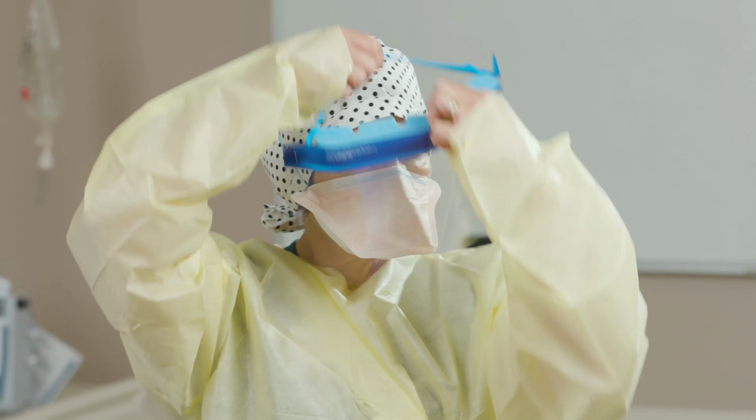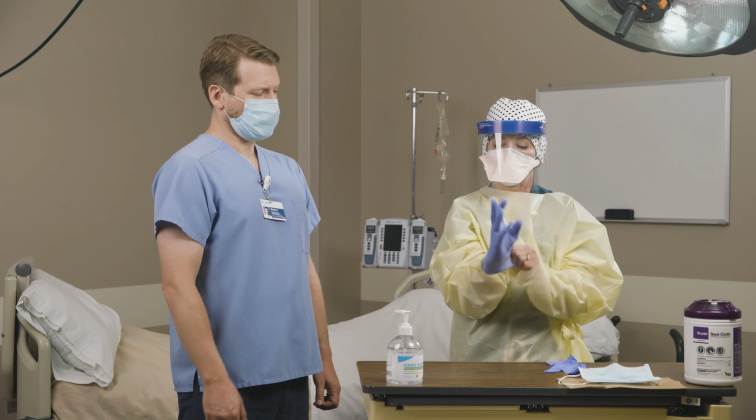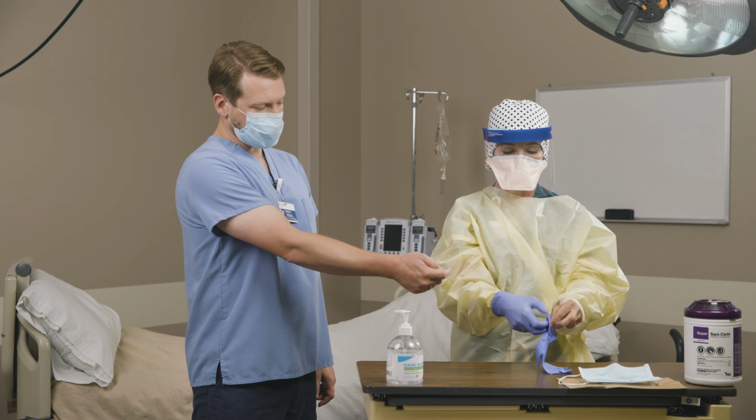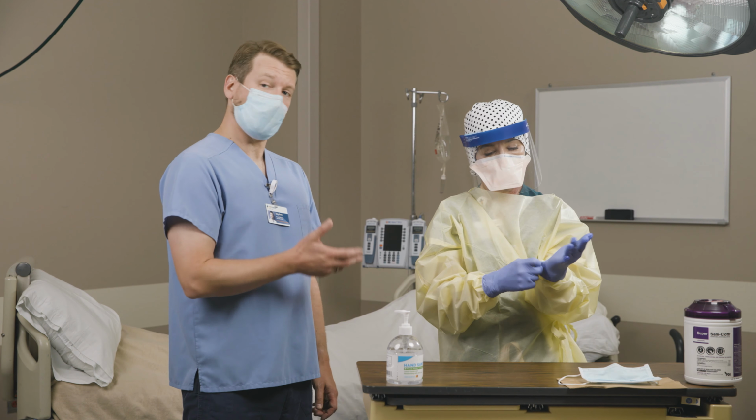Krista's then going to place her face shield. And finally, Krista's going to don her gloves. Make sure the cuff of your glove extends beyond the cuff of your gown. And now she's ready to enter the patient room.